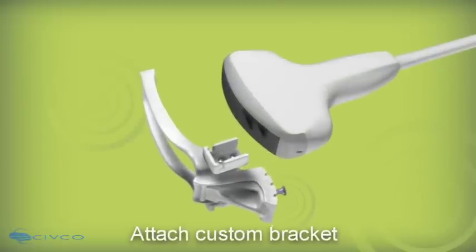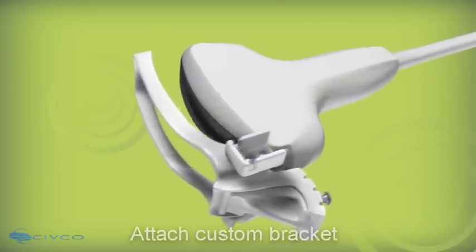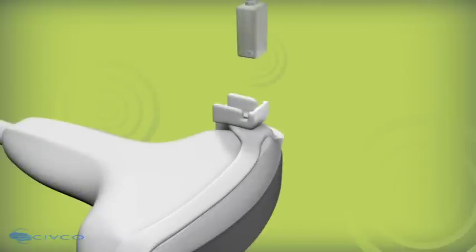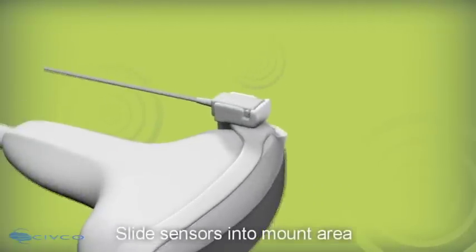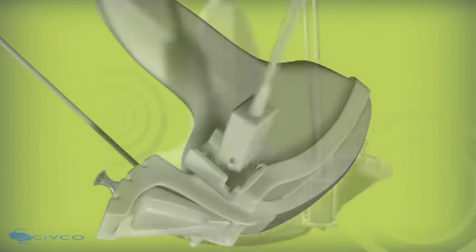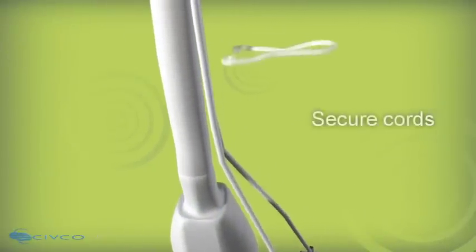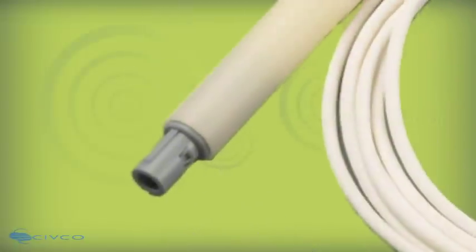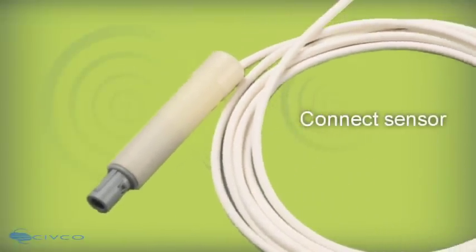First, attach the custom reusable non-sterile bracket to the transducer by aligning the locating features. Then slide the non-sterile reusable general purpose sensors into the designated mount area on the bracket. Secure the sensor cord to the transducer cord with the probe clips. Next, connect the sensor into the tracking panel on the ultrasound system.